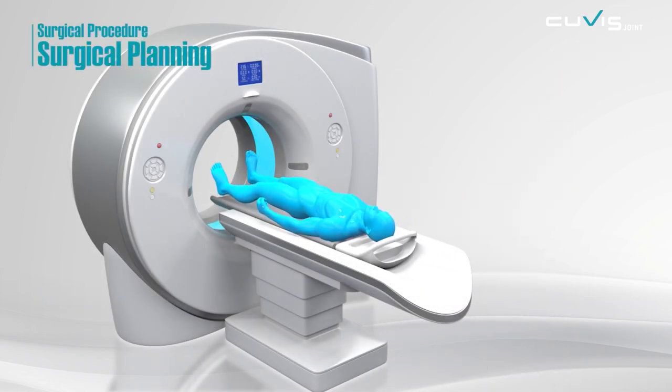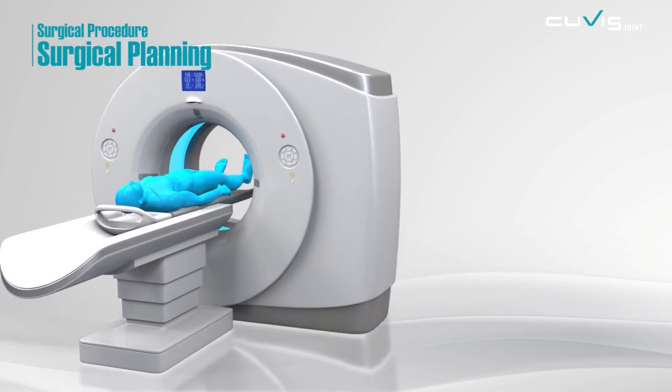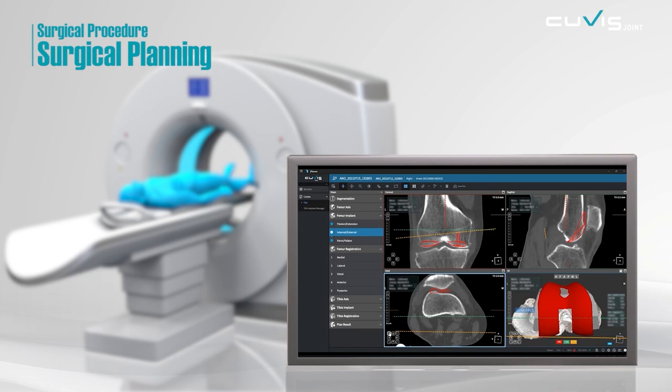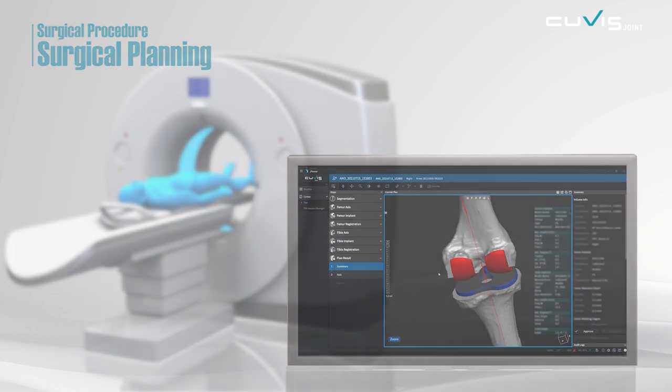For a personalized surgical plan, patients will take a CT scan. After the CT data is loaded in the planner, the planner will automatically create a 3D image. This will make a patient-customized surgery plan based on the patient's leg axis alignment, joint gap, the implant's orientation, and angle.